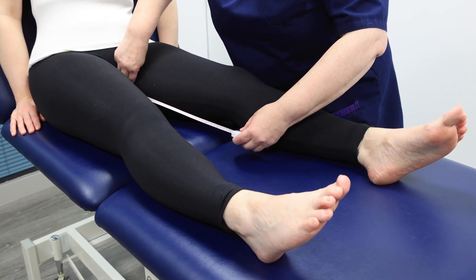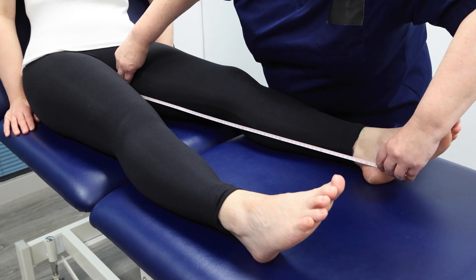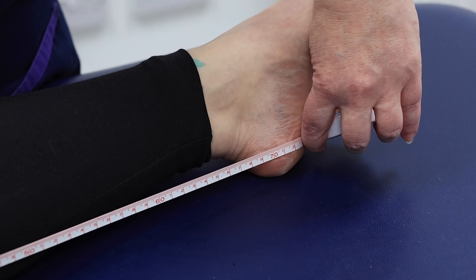Measure the inside leg length. Measure from the groin to the heel. Here, it is 74 centimetres.